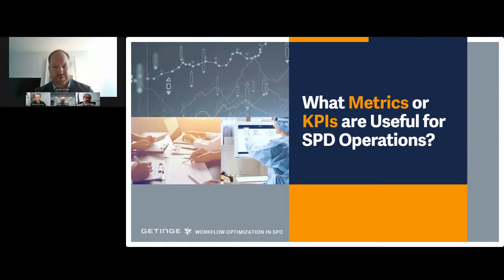And then doing the time studies. There are so many different points that you can measure. From the time it hits decontam to the time it hits the sterilizer, from the time it hits decontam to the time it hits the washer. There are so many data points that you can measure and have that continuous process improvement with the addition of that management engineering team or performance services. So don't think you have to do it alone. There are people in your facility that can help you.